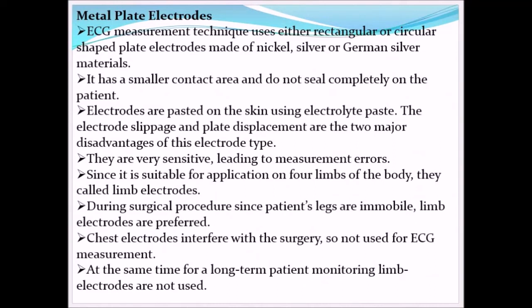Before placing the surface electrode, we use electrode paste. The electrode paste is used to have good contact between the electrodes and the contact area. The contact area can be any place.